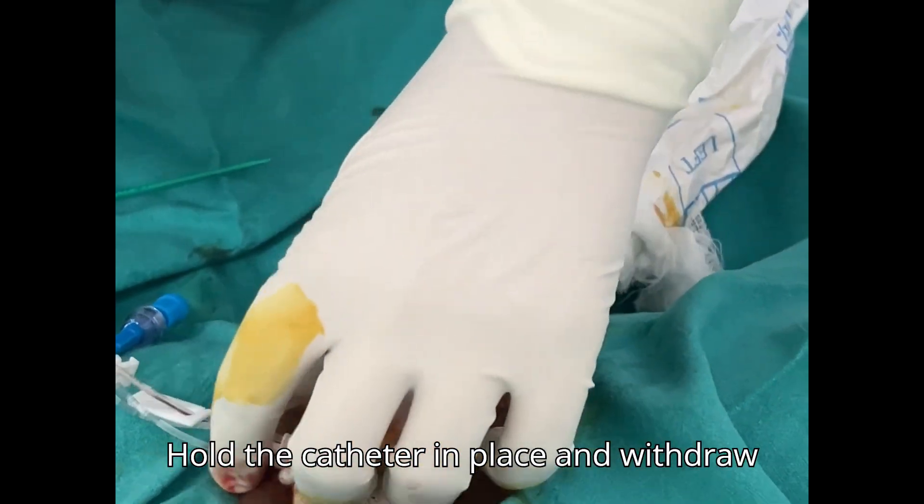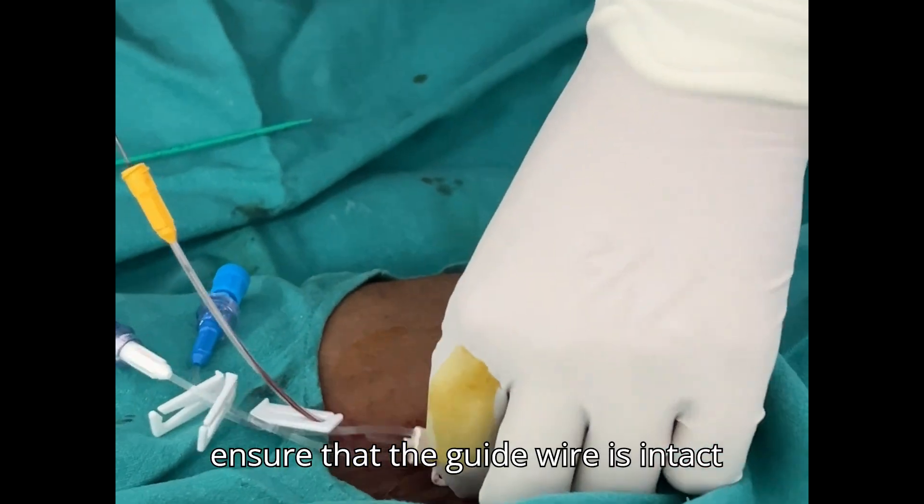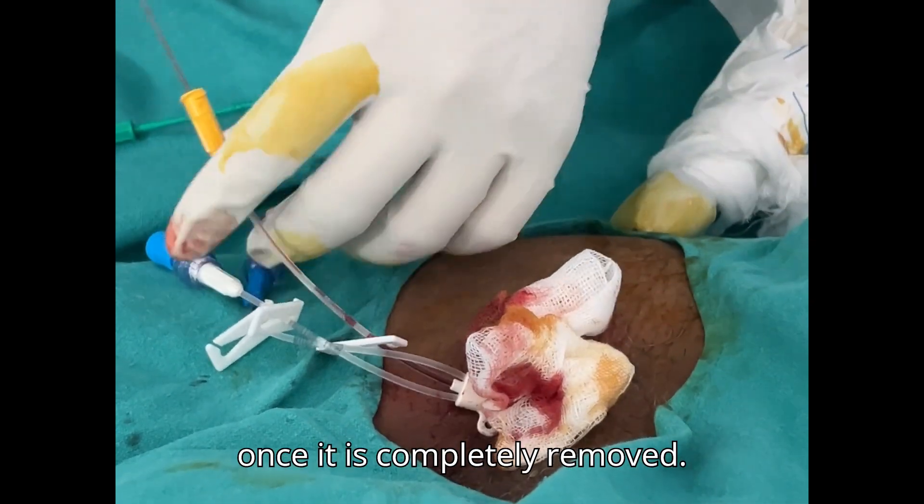Hold the catheter in place and withdraw the guide wire. Ensure that the guide wire is intact once it is completely removed.